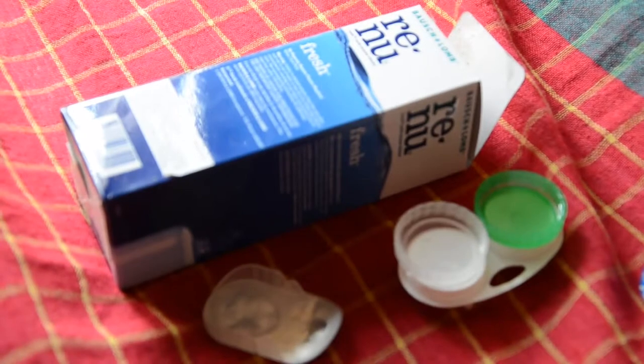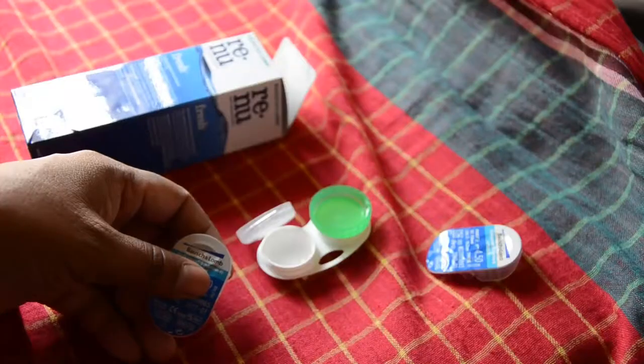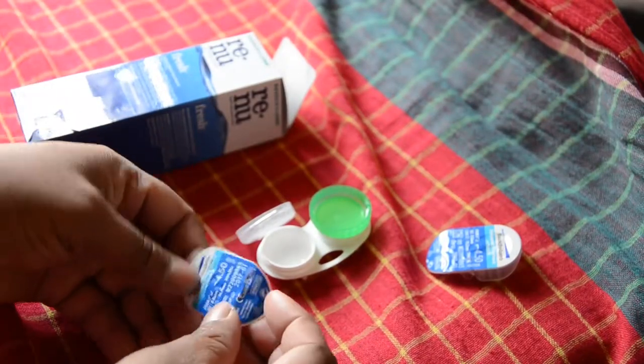Hi, welcome to this video. In this video, I'm going to give a demonstration of how to fill liquid to your case. I'm going to use a Renew liquid and Bausch & Lomb lens.